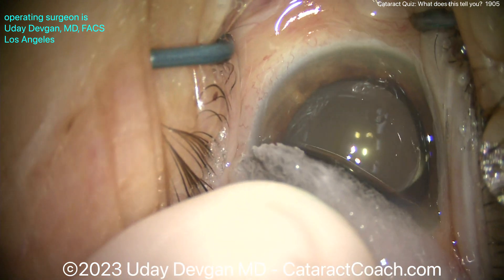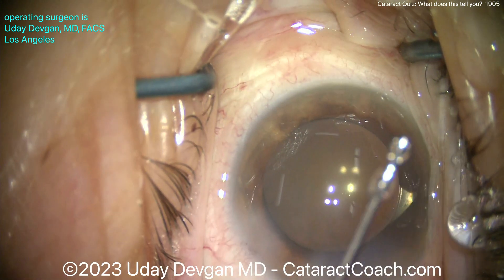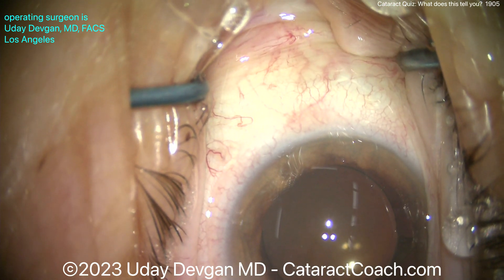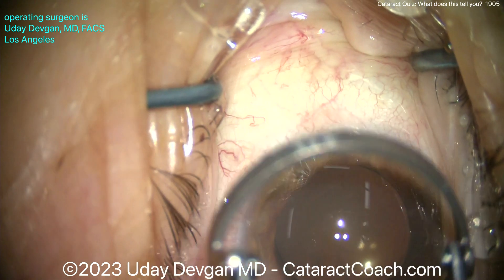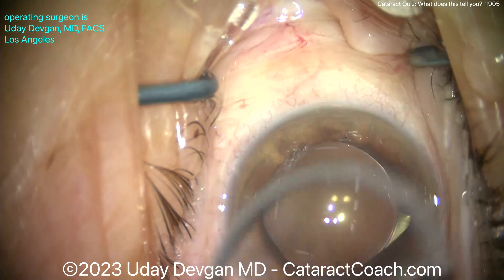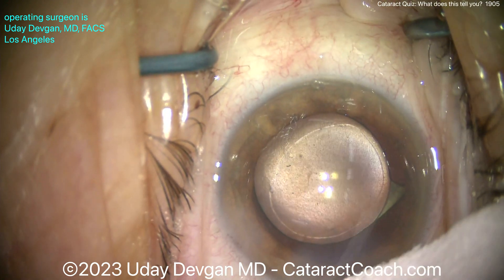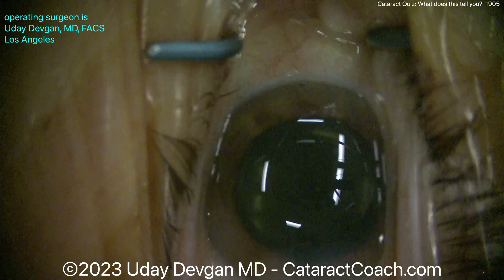The IOP looks normal, everything looks good. Let's put a sponge on here with a little tetracaine to anesthetize the eye — we're going to do a limbal relaxing incision. Just because it's a challenging case doesn't mean the patient doesn't deserve a beautiful refractive outcome. So let's do a little LRI to account for about 0.5 to 0.6 diopters of astigmatism. Notice we also placed the main phaco incision on the steep axis. Here's the diamond to make a one clock-hour LRI — and that looks fantastic. Next time you see that critical sign — capsular bag equator — now you know exactly what to do.